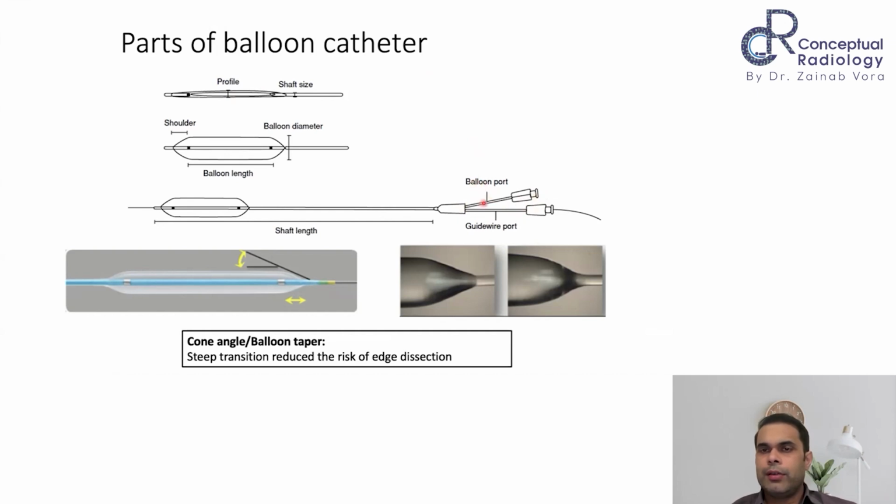And one is the one in which you can inject contrast or liquid to inflate the balloon. So this is connected to the balloon and it will inflate and deflate the balloon. Whereas the second lumen is the port through which we put the guide wire. Also, if we are at a particular location and we want to inject contrast and see, we can put a wire, remove the wire and take a run as well. So this double lumen balloon is what we currently use.